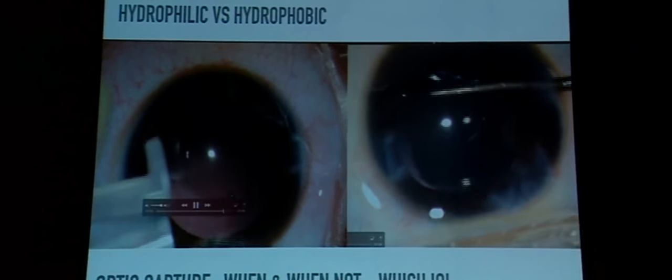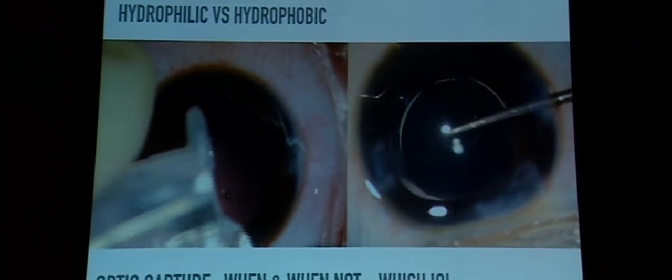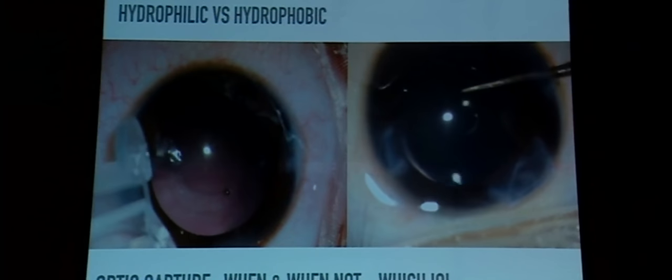Smaller gauge vitrectomy cutters — 23, 25 gauge — are now available. Going around the IOL after lens placement is also possible but can be less controlled and may risk extension of the posterior capsulotomy, which is not desirable. If not placing a lens, the vitrectomy and posterior capsulotomy can both be done through the side port with the cutter.